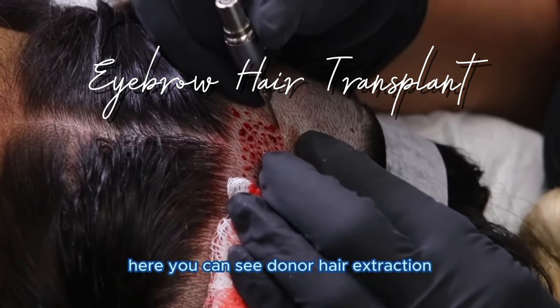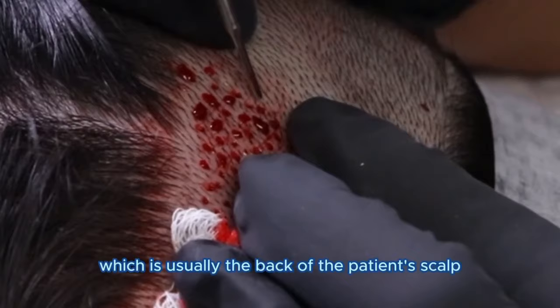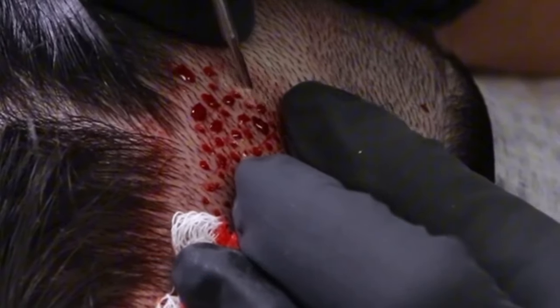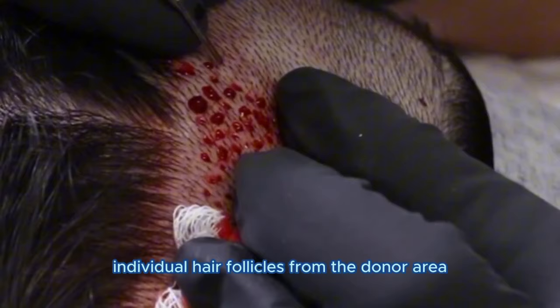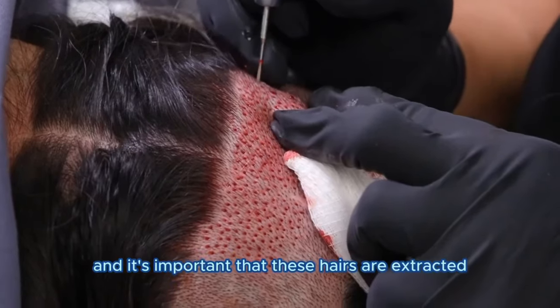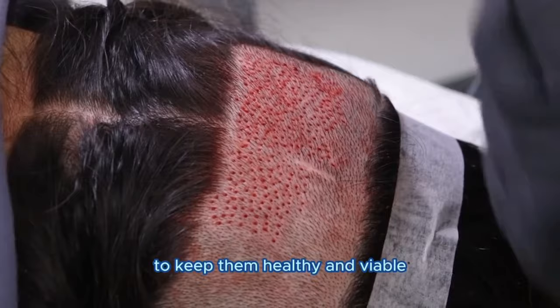Here you can see donor hair extraction. This step is the extraction of hair follicles from the donor area, which is usually the back of the patient's scalp. We use a specialized tool to extract individual hair follicles from the donor area, and it's important that these hairs are extracted one at a time and placed in a solution to keep them healthy and viable.